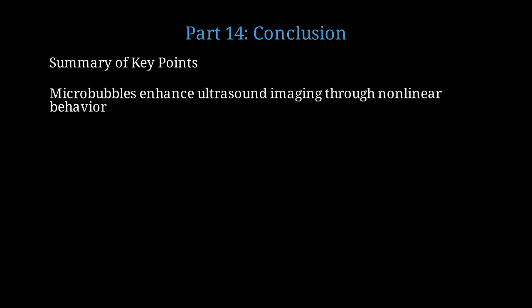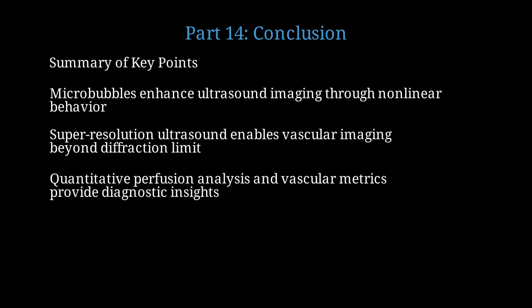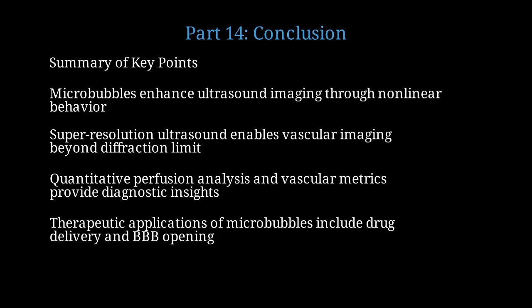Microbubbles exhibit nonlinear oscillations, generating harmonic frequencies that enhance ultrasound imaging. Superresolution ultrasound achieves subwavelength resolution, enabling detailed maps of microvasculature. Quantitative analysis of perfusion and vascular metrics offers valuable diagnostic information for various diseases. Microbubbles can be used for targeted drug delivery and temporary opening of the blood-brain barrier for therapeutic purposes.